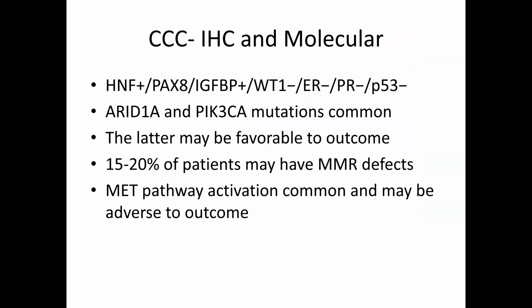So in terms of immunohistochemistry and molecular analysis, NAPSIN A and HNF1B are positive in this tumor. Didn't include the NAPSIN-A on this marker here. They tend to also be PAX8 positive, but they'll be negative with WT1, negative with the hormone receptors, and usually do not harbor a p53 mutation.